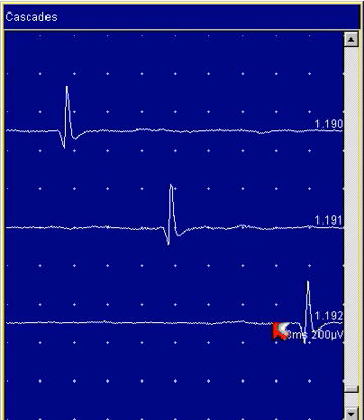Here are three consecutive sweeps of the EMG signal saved in the system memory. The waveform repeats three times. Therefore, it is a motor unit action potential.